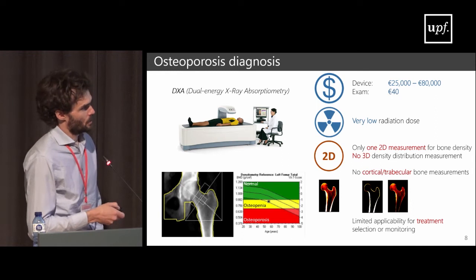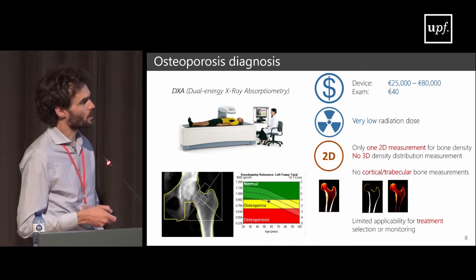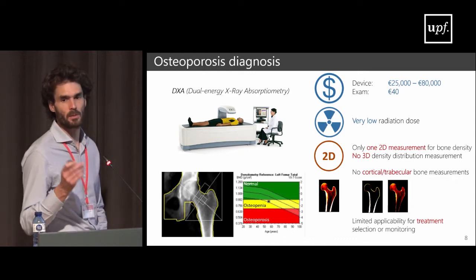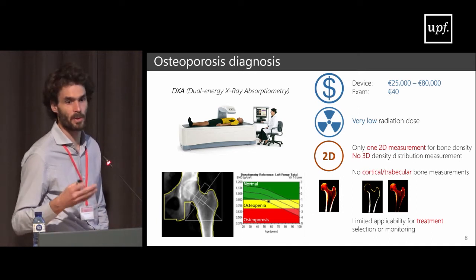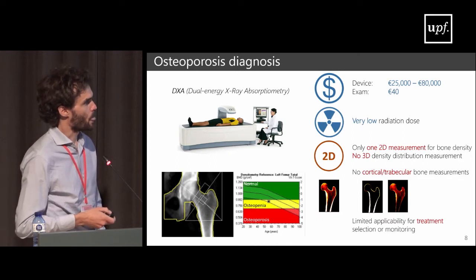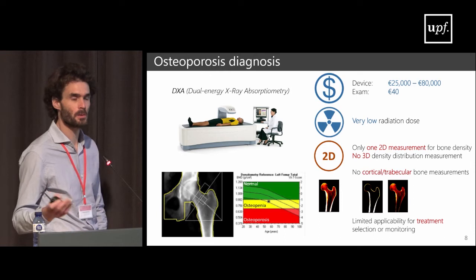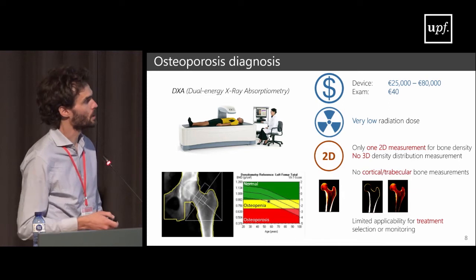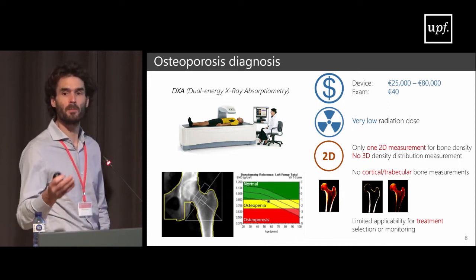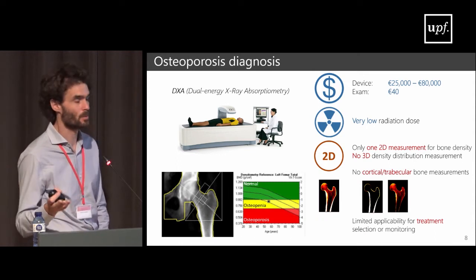Okay, so here you have the normal bone density in green, then you have osteopenia, which is a low bone density, and here you have the osteoporosis range, which is the pathology. In this graph, what we also have is the average density in the general population against age. Here's the curve for women. We're all losing bone density, so there is something that's happening to everybody. It's not a pathology, it's a natural process.